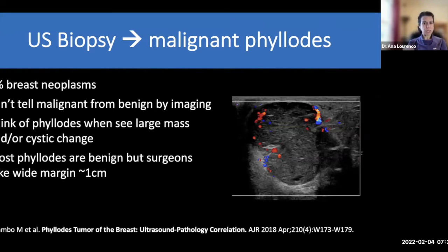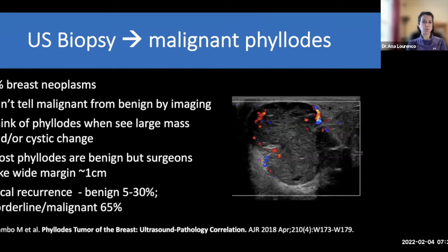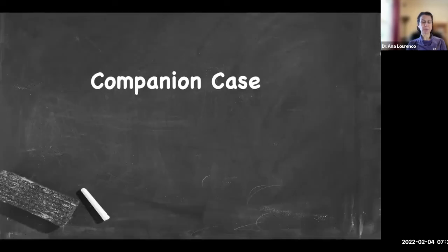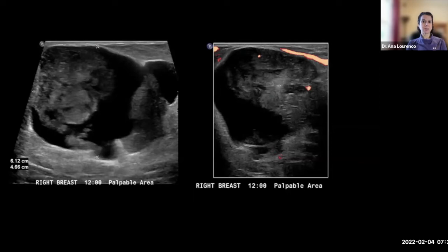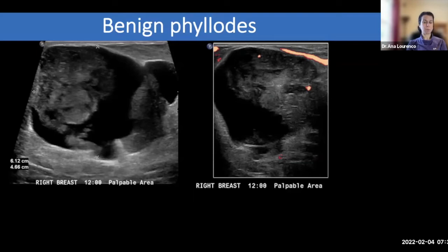The vast majority of phyllodes tumors are benign, but surgeons will take a wider margin — about one centimeter — because even when benign, they can locally recur. The recurrence rate is 5–30% for benign phyllodes, and as high as 65% for borderline or malignant. Here's a companion case — even bigger at six centimeters, definitely with cystic change and solid components with internal vascularity — this one was benign phyllodes at biopsy. We really can't predict with imaging which is malignant; that's for pathology to diagnose.